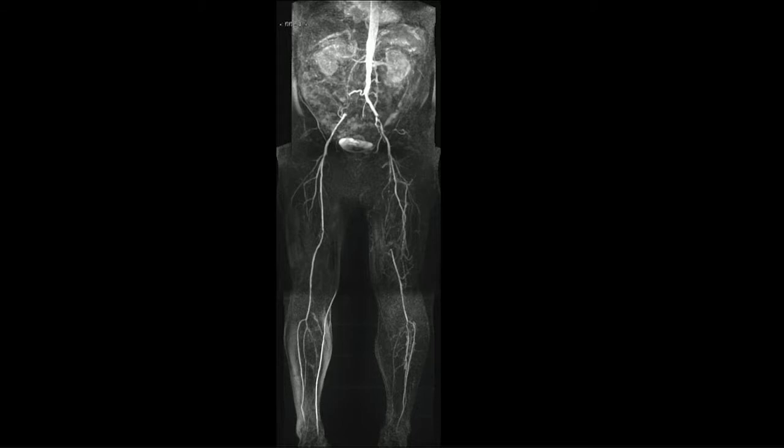We routinely knit these together for the vascular surgeons. You can see the artifact in the area where the 3 stations have been overlapped together over the common femorals and the proximal popliteal and adductor canal. Unfortunately, that coincides with some of the areas that are predisposed to atherosclerotic disease in the common femorals and the adductor canal. And this is one argument for doing a 4-station angiography, widening the region of overlap to try and minimize this sort of artifact.